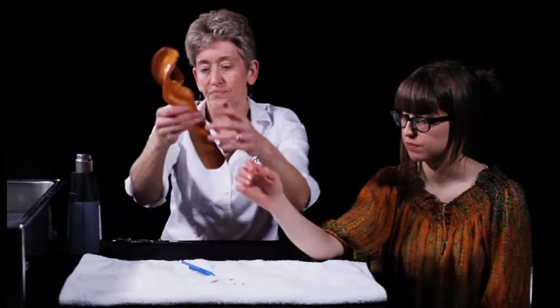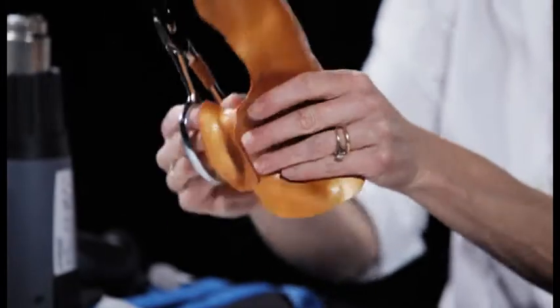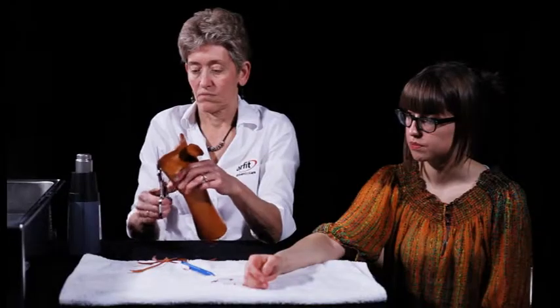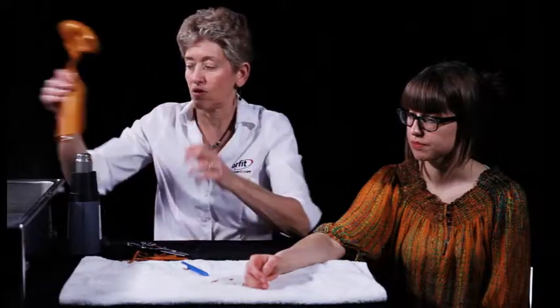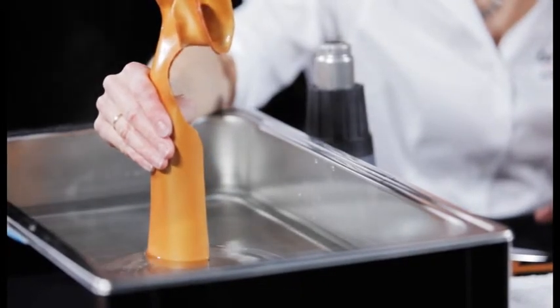Remove the orthosis from the patient and trim, leaving a nice, smooth edge. Briefly heat the proximal edge of the orthosis and slightly flare away this edge with the fingers.